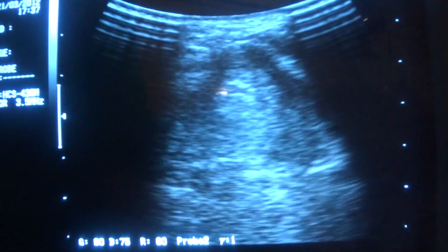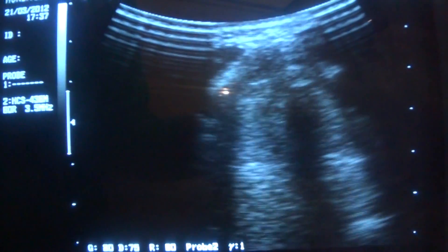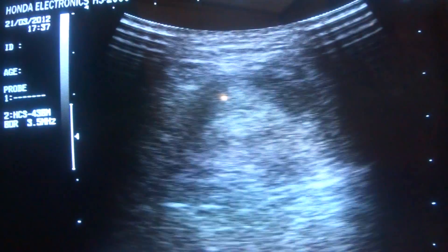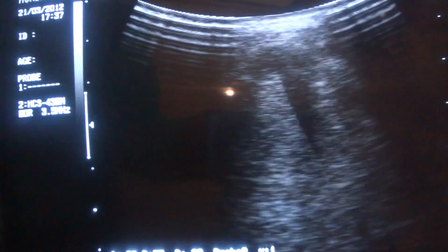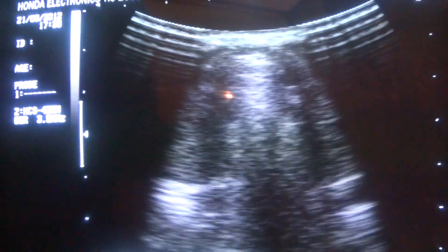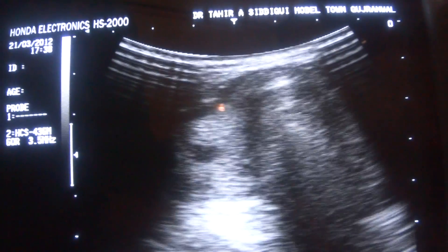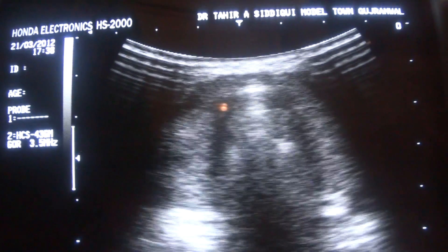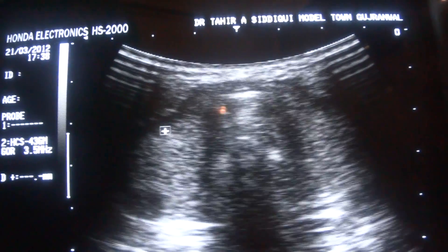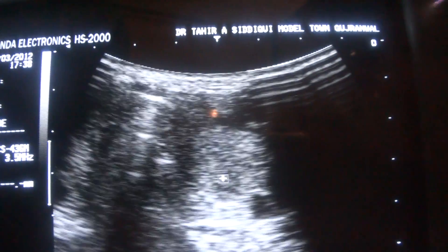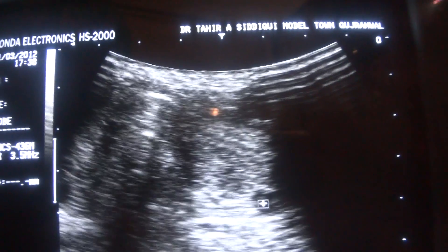This is an ultrasound study of the thyroid gland, which is normal. Place the probe transversely and here we are. This is the right lobe and this is the left lobe in transverse section.